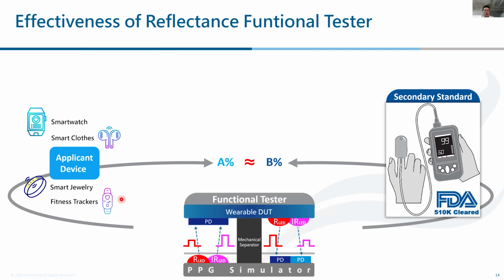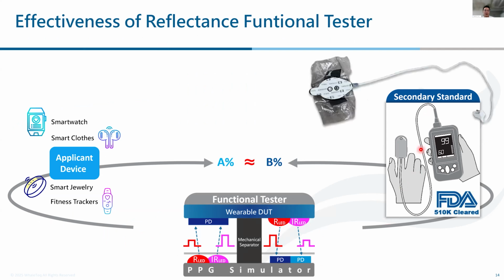So as we are going to adapt this, how can we be sure this is working great? We can use a standard to have a functional experiment with the functional tester to see how it's working. This is the finger socket, and this is the reflected interface. So we would need a patch that can work reflectively with this kind of test interface.